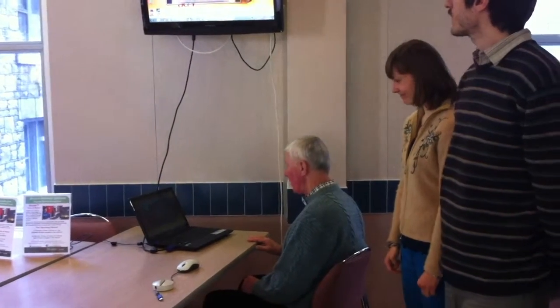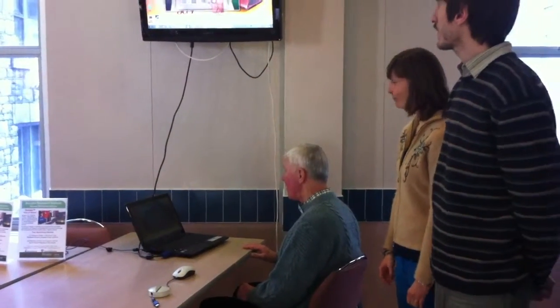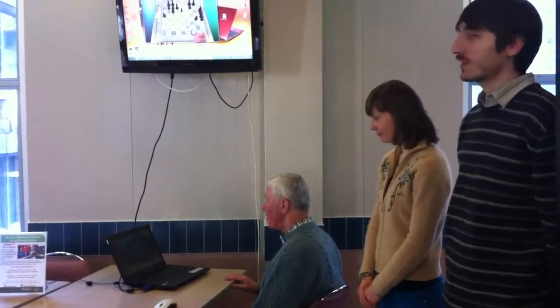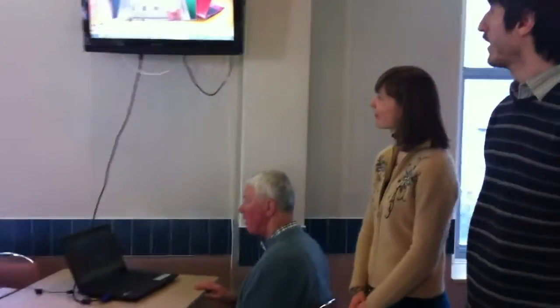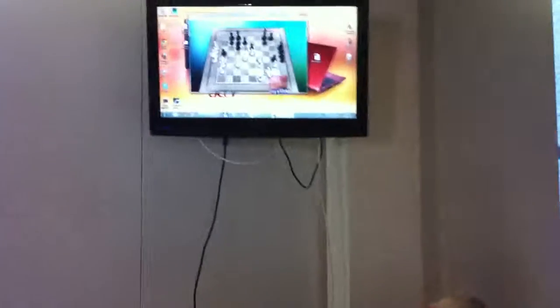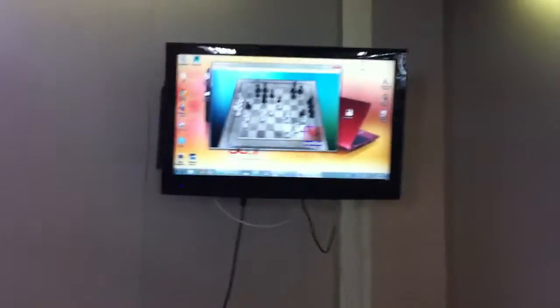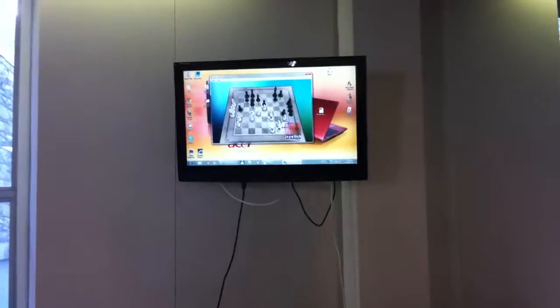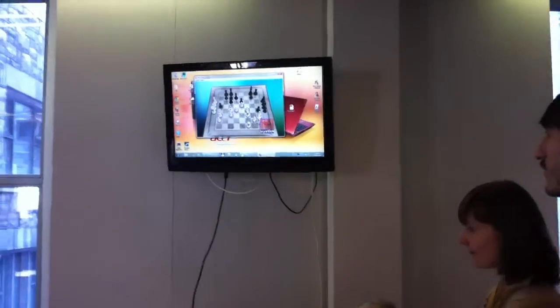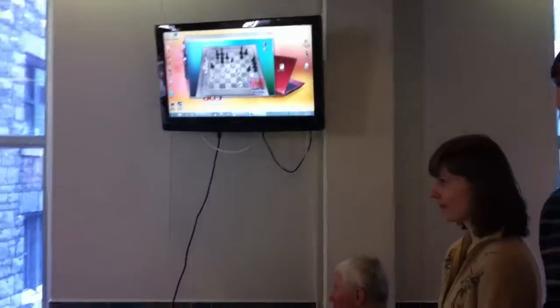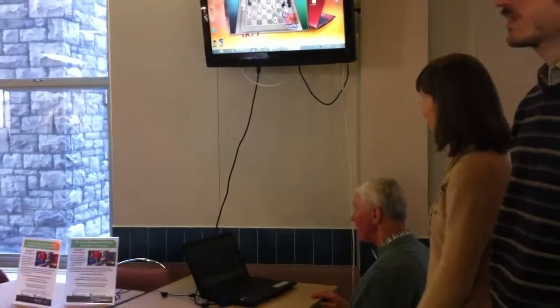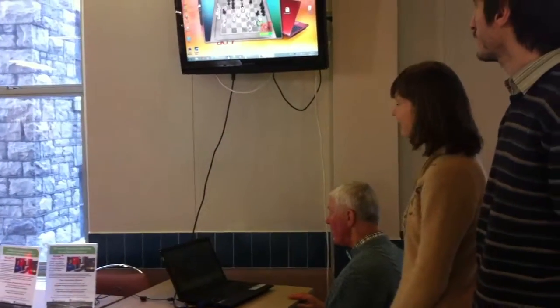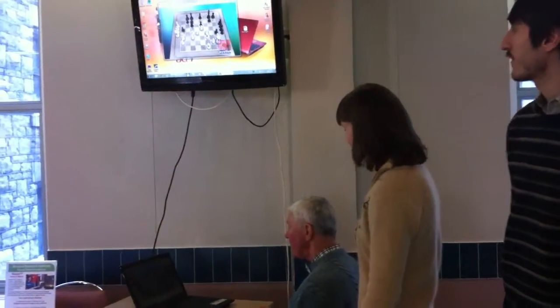Through the settings you can alter the time that you need to stay still or to click. You are also able to browse the internet, type on your keyboard, download books from public libraries, listen to audio books — and it gives you further versatility using your computer without using your hands.